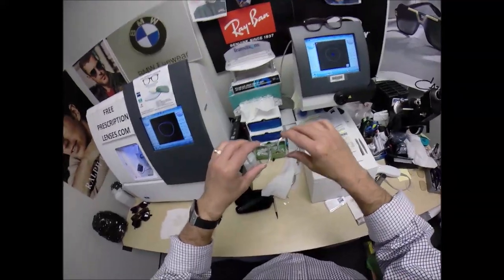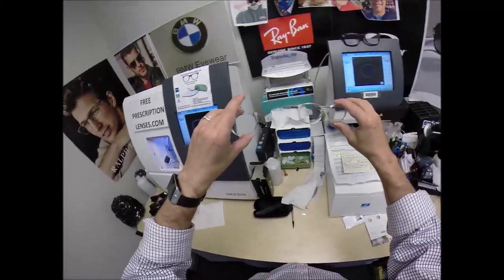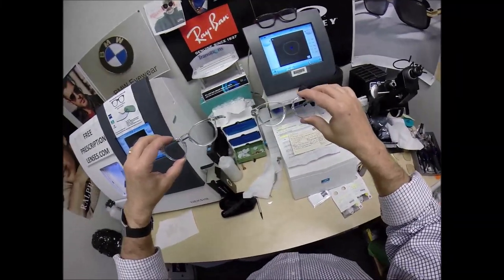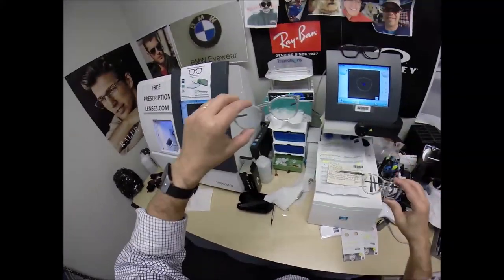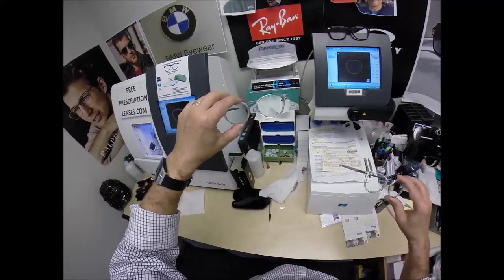Robert's getting the same exact frame that I'm wearing, except something tells me he's going to make it look better than I do. Now, our prescriptions are almost identically opposite. Does that make sense? He is a -1 in each eye with a quarter astigmatism. I'm a +1 in each eye with a quarter astigmatism in both eyes.